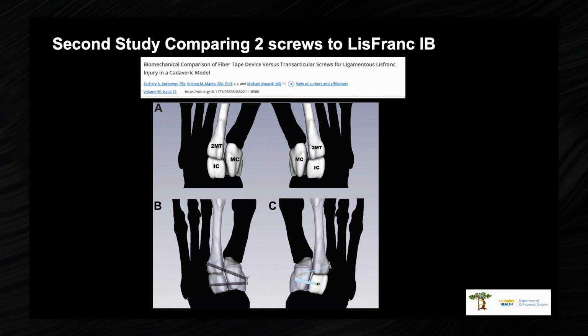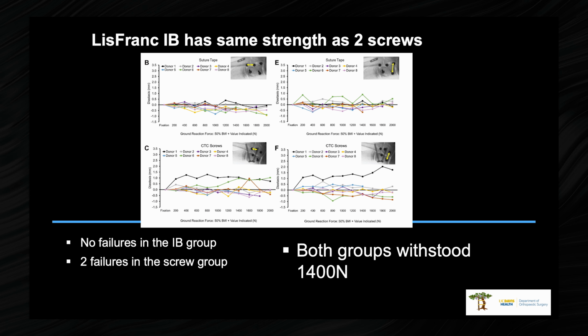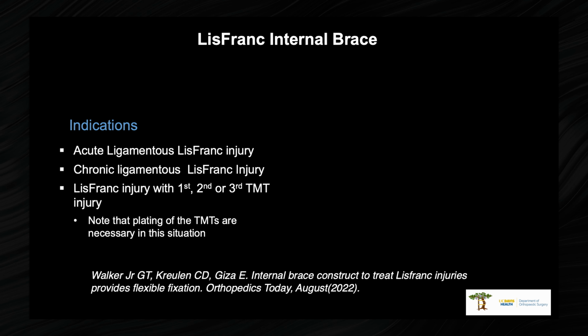And so that was published, and then the follow-up study, which was published in the American Journal of Sports Medicine just a couple of years ago, was 2 screws versus LisFranc, because obviously our trauma colleagues are always like, I just do 2 percutaneous screws, and that's all you need. And the LisFranc InternalBrace over the top construct is just as strong, 1,400 newtons, but no failures. And in the screw group, a couple of them broke. And we all know that's the kiss of death. If you have an athlete and you have a broken screw, that's no fun.